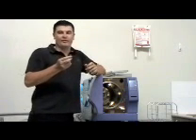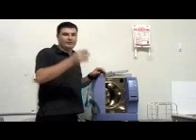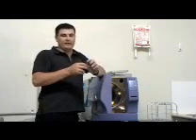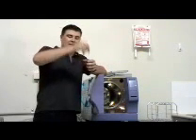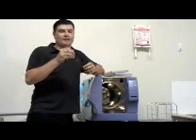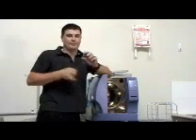It is important to note every now and then that the drain filter is situated correctly in the back of the chamber, because if it's not pushed down correctly, there is the possibility that it may pop up.